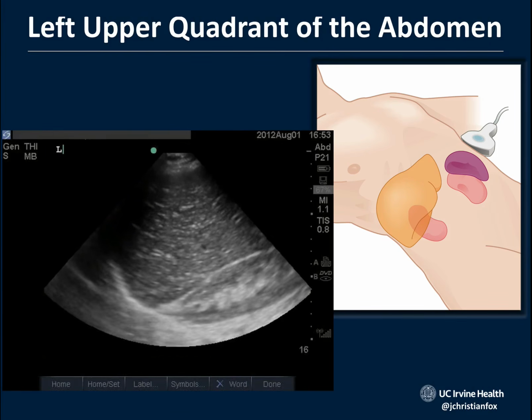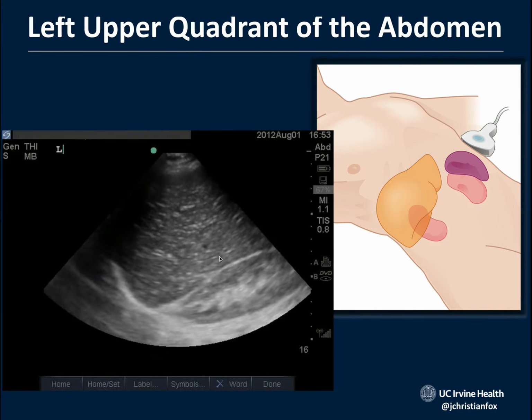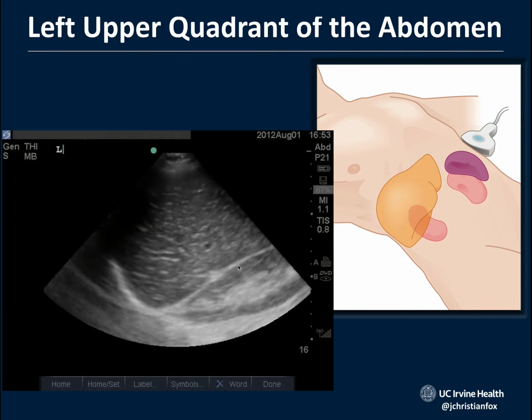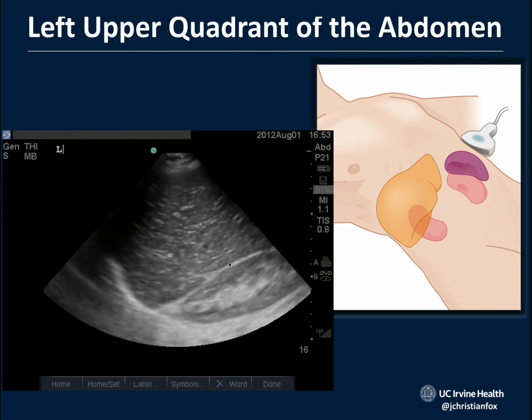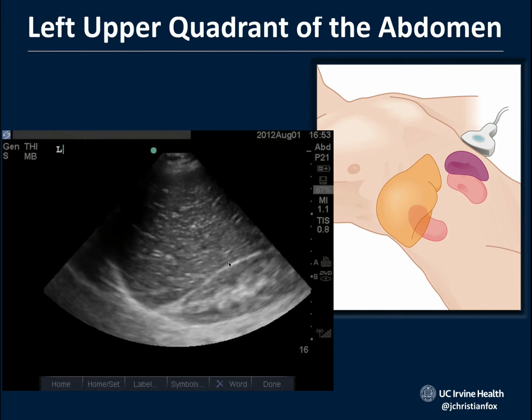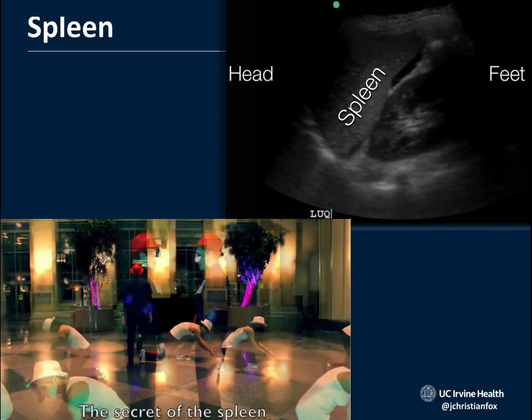And finally, the spleen. The spleen is a very enigmatic organ. It can be very enlarged in cases such as this patient right here has infectious mononucleosis. They had some submandibular lymph node enlargement, a sore throat, a fever, some malaise, and we saw this huge spleen on them. And so pretty prominent looking structure here on this particular patient. They're usually not that big. Here's the kidney over here. And again, another example of the spleen here adjacent to the kidney. But the question is, what does the spleen really do? That's the question I still have not been able to answer.